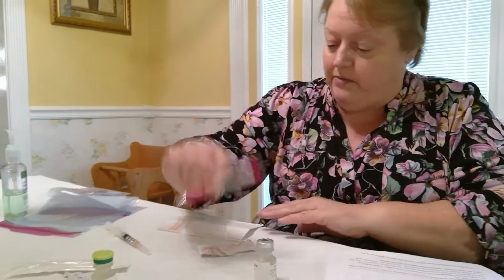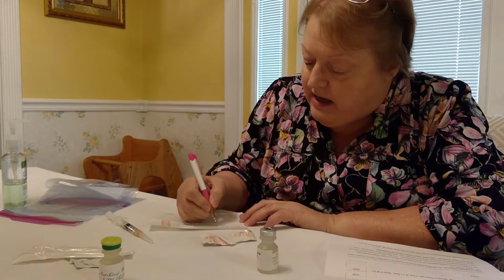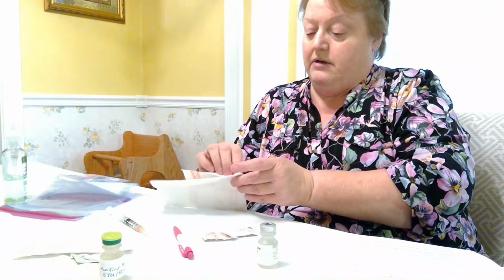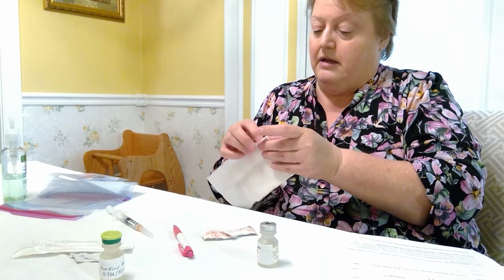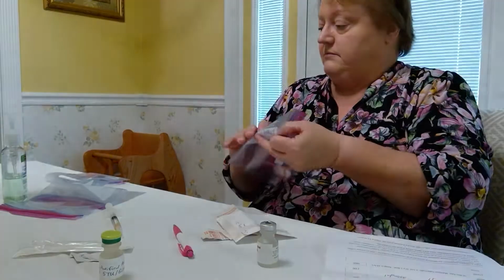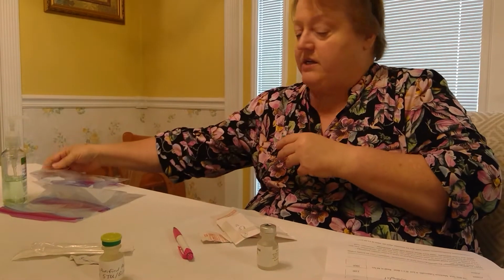You're going to make a label as such, naming the drug, the amount, and how it's to be given and who it's to be given to. Apply that label to your bag. And you have your second one ready to go.